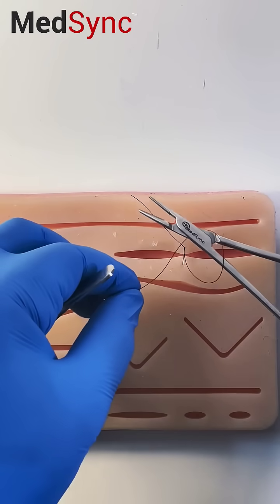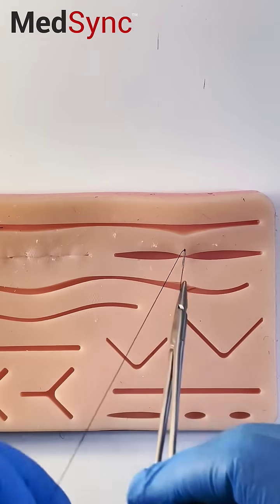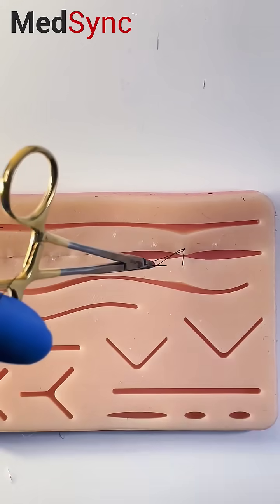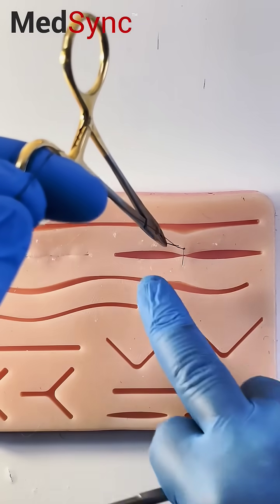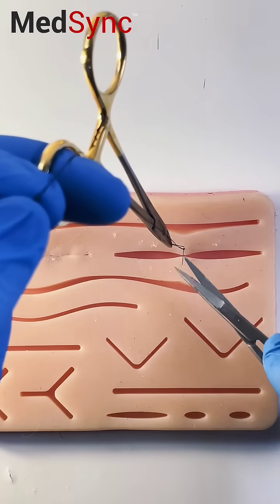You have now eliminated the central point of most tension across this wound to make your deep dermals easier to place without tension.